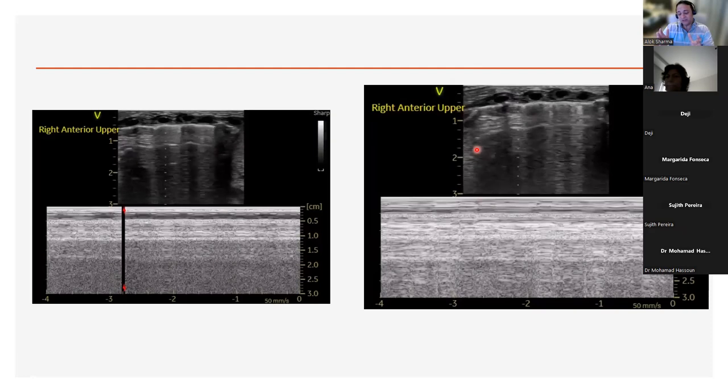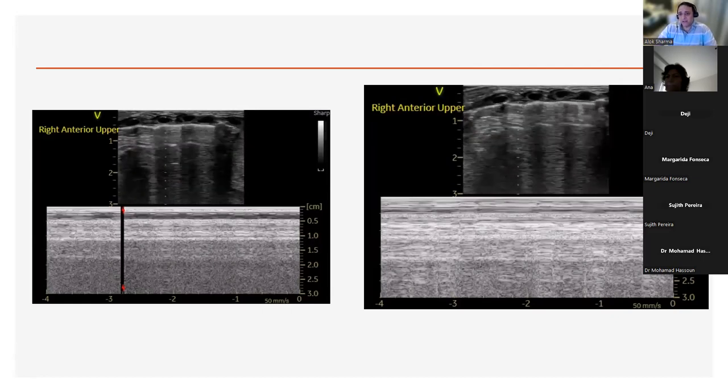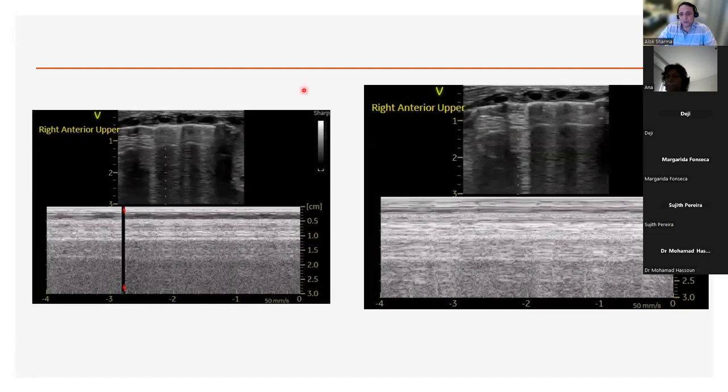People look at the size of the pneumothorax, and the pulses are fine and the baby's saturating, and just looking at the size, they say, oh, that's a tension pneumothorax. Actually, it's a clinical diagnosis. And that's the reason why you would clinically needle or put a chest drain in after a needling, once you've made a clinical diagnosis of a tension pneumothorax. If the baby is deteriorating, you wouldn't wait for either of these two modalities.